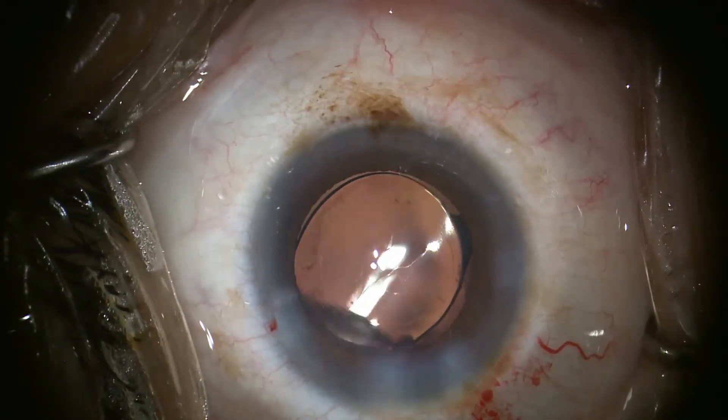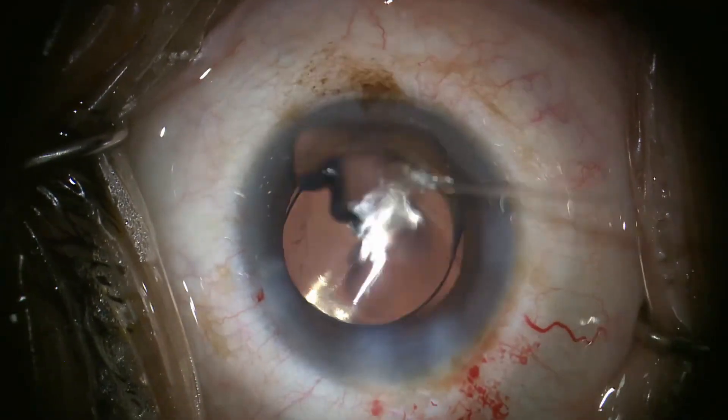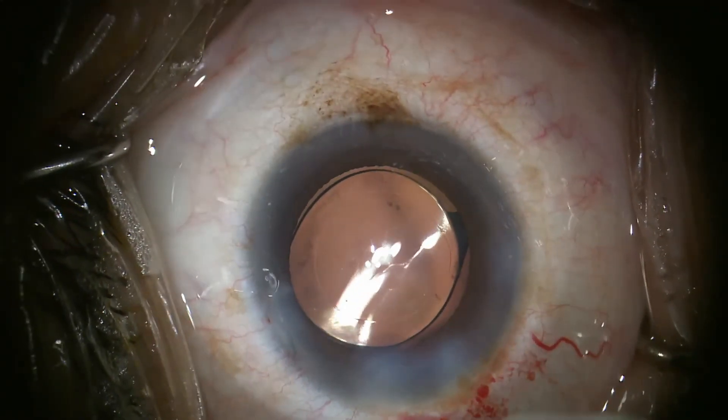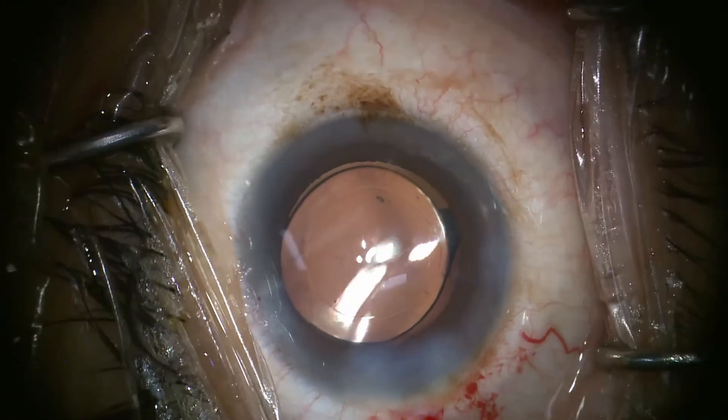The eye is filled to an appropriate pressure with the infusion placed across the incision. Then a sponge is utilized to test incision seal and IOP prior to removing the Lieberman lid speculum.